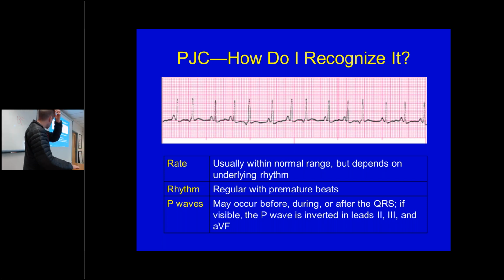Couldn't that be a PAC, if it just depends where it's firing and sending that signal away from us? What do you mean? Well, a PAC is not going to be inverted, right? If we see depolarization going away from our lead, we'd have an inverted P wave. Why would you have depolarization going away from the lead in a PAC? If we had an excited cell close to our AV node, and it's sending a depolarization back towards the SA node. Put your little wire on that.